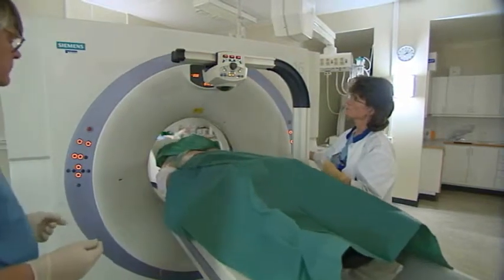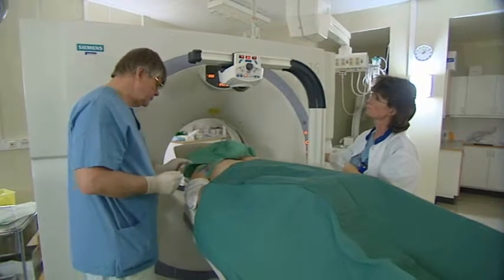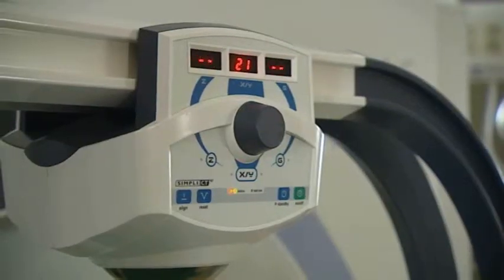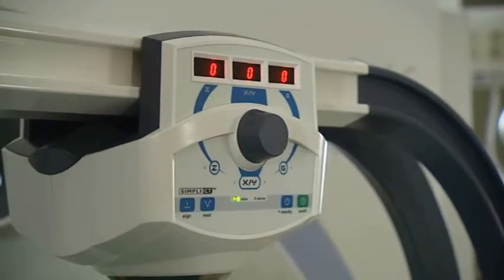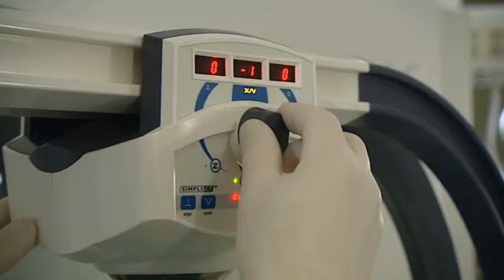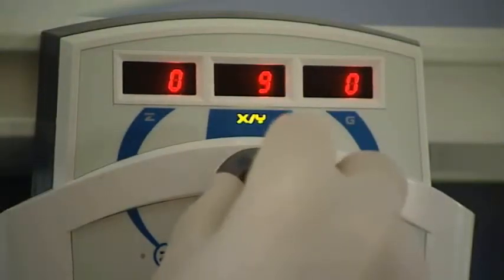The SimpliCT is powered on by pressing the green on-off button. And the axial plane is chosen by pressing the XY button. The calculated angle is then entered into the SimpliCT by rotating the angle input wheel.